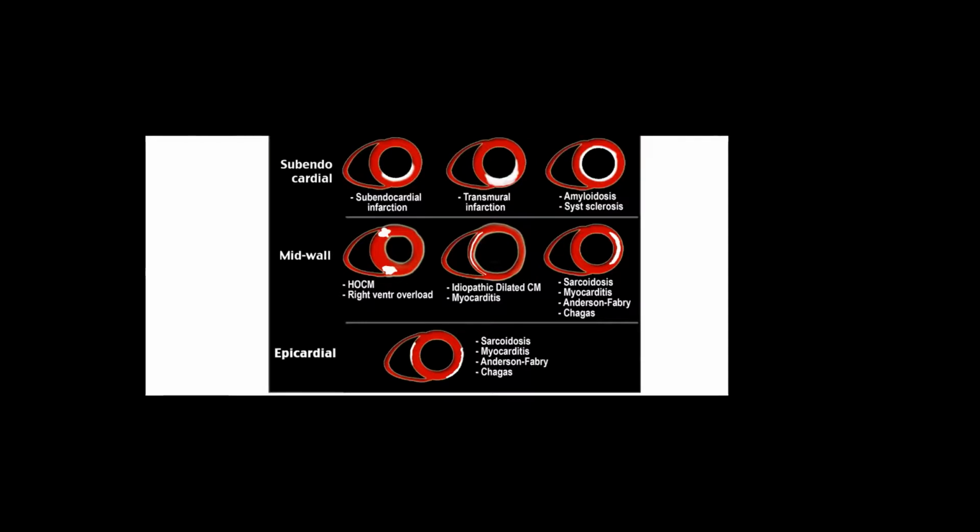But the most important thing CMR does is tissue characterization. I mean, if you have a mass, you can see the characteristics of the tissue in that mass by CMR. And the other thing is the hyperenhancement pattern for cardiomyopathies.